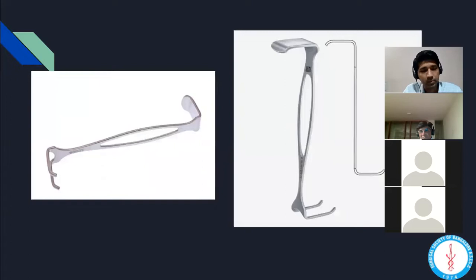The thing is, people must understand when they select retractors, they must think that the length and the width of the blade, that ratio must be 3:1. Anything different from that, either it will be too long or too short. Then we have the Zerni's retractor.